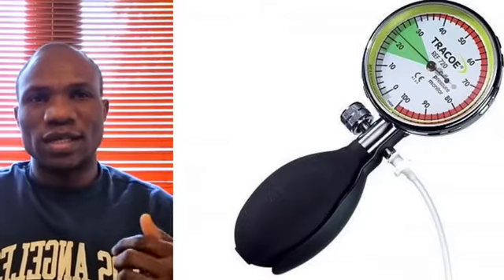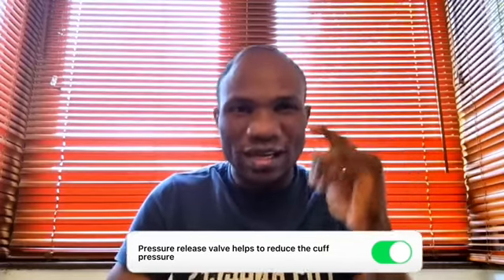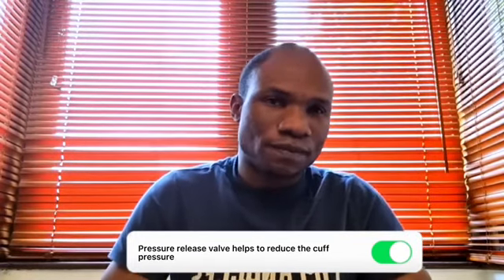The second part is a pressure release valve. That one is located at the back of the instrument. The pressure relief valve performs the opposite function of the rubber bulb handle, in the sense that it is important if the pressure is too high. So if you measure your cuff pressure with your instrument and discover that it is too high, you can just press the pressure release valve to release the pressure, to reduce it to the level that you want.